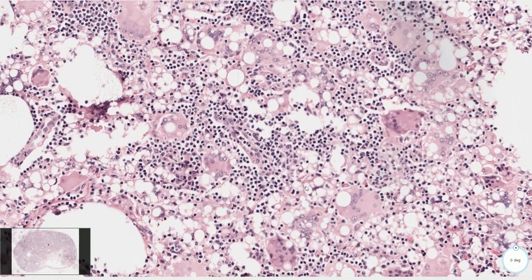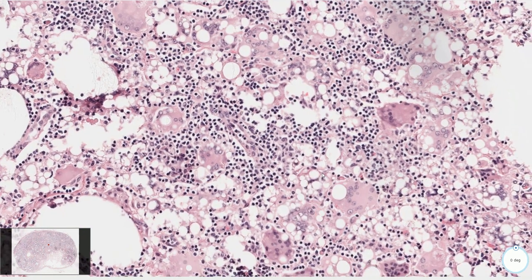Let's take a look at this cell. When these vacuoles are located inside the cytoplasm, they can even cause indentation of the nucleus, and they can mimic lipoblasts.